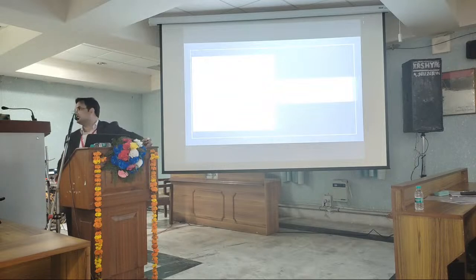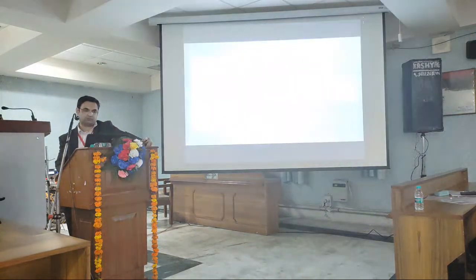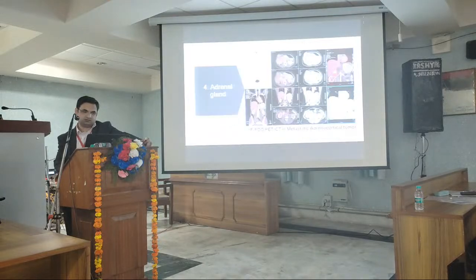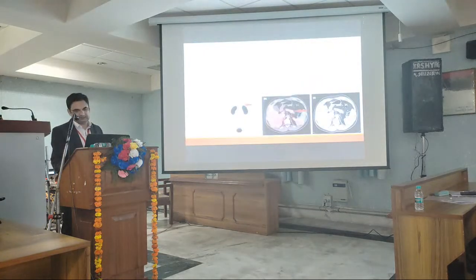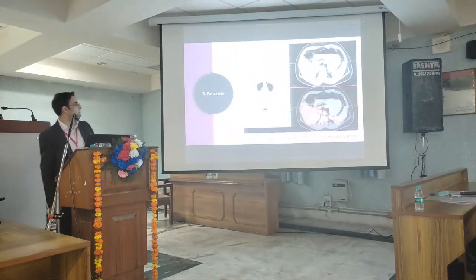The only other point is about your insulinoma case where you showed a big insulinoma uptake. Was it not visible on CT scan, because apparently you showed a large lesion? The patient had a triphasic CT, and despite that, the radiologist was not able to localize it. You are talking about this case.